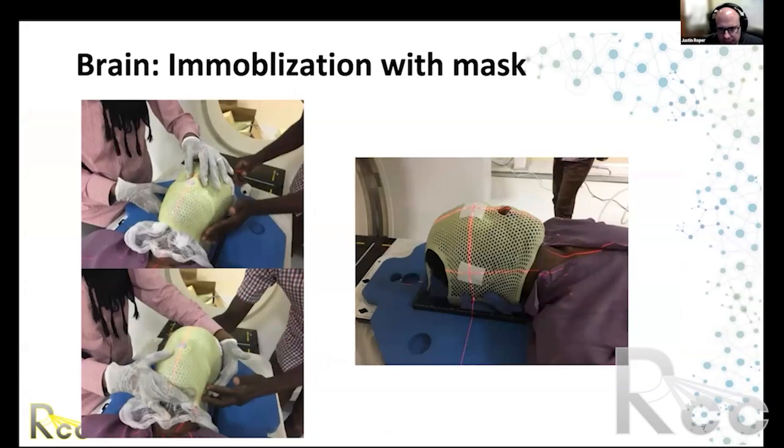Once that plastic sheet is pliable and can be deformed, it is draped across the patient's face and then secured in 3 locations, on either side laterally and at the top of the head. During this process, it is very important to have at least 2 sets of hands, even 3 sets of hands, because the mask does dry or cure somewhat rapidly.